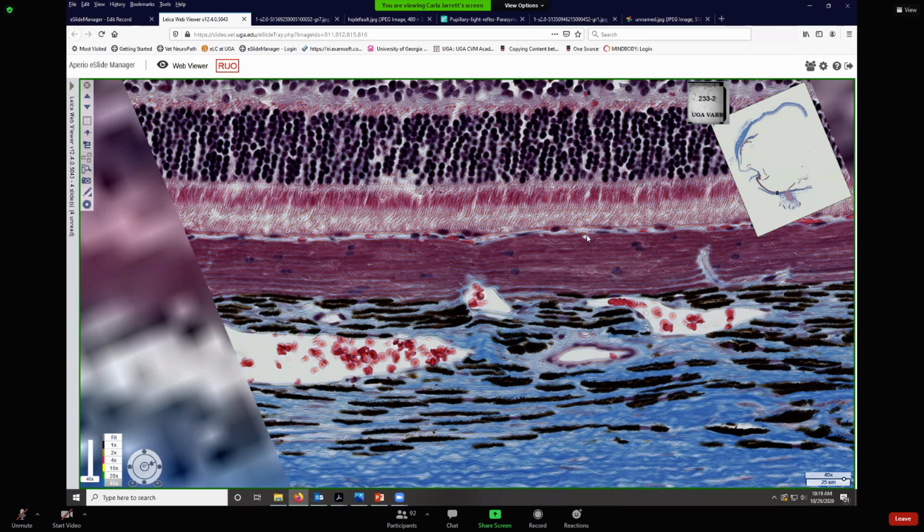Again, the choriocapillary layer. Now, the retinal pigment epithelium is not pigmented right here. That's another clue that I'm looking at the tapetum. Because if the RPE, the retinal pigment epithelium, had melanin in it right here, then the photons of light couldn't pass through those cells and penetrate the tapetum, or bounce off that tapetum, if you will, and get a second chance by passing back through the photoreceptor cell layer. So a photon of light would be coming like this.